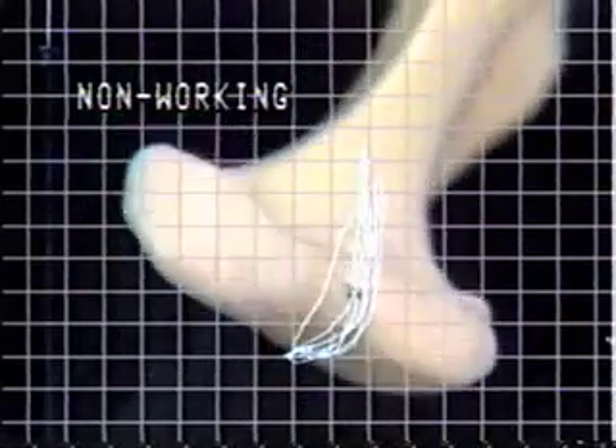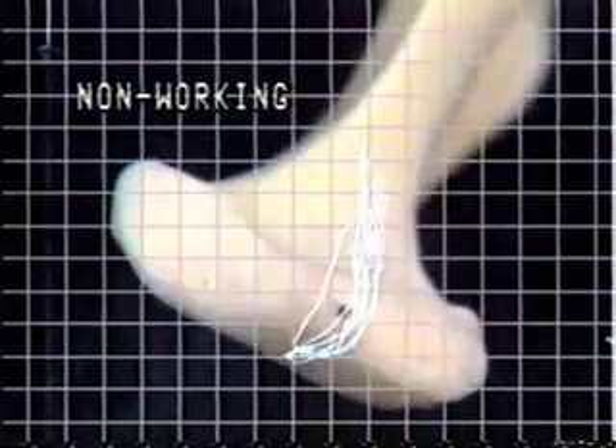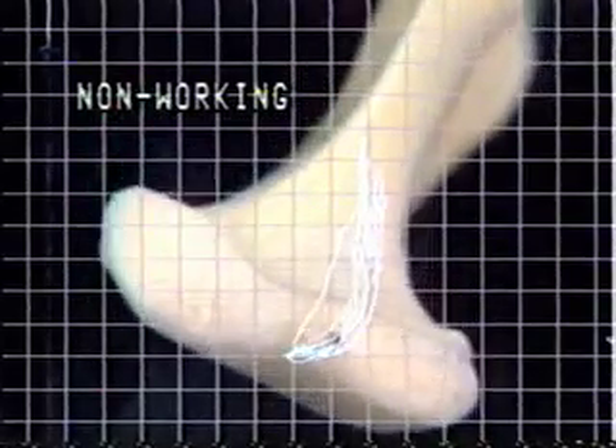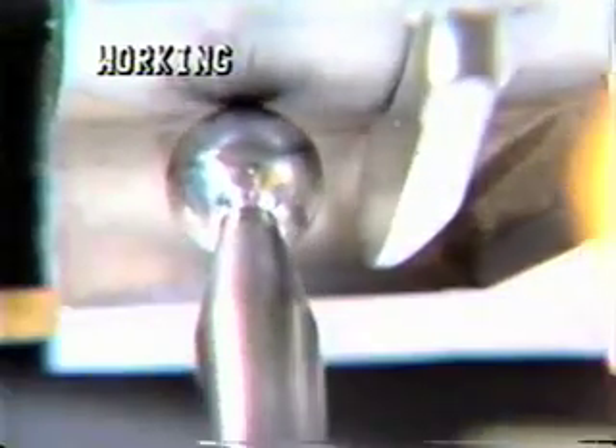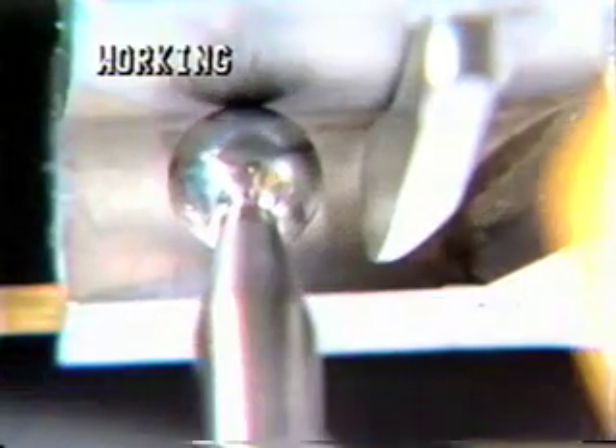The grid is made up with two millimeter-sized squares. The articulator, mounted in the replicator, demonstrates movement of its lower member while being driven by the chewing data. The Bennett movement component is seen taking place in the retruded part of these working side chewing cycles.